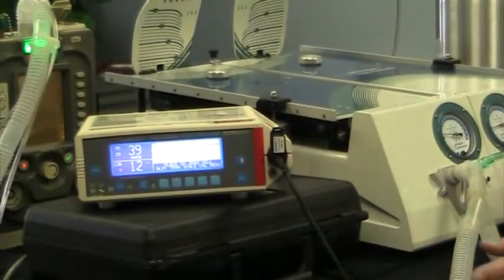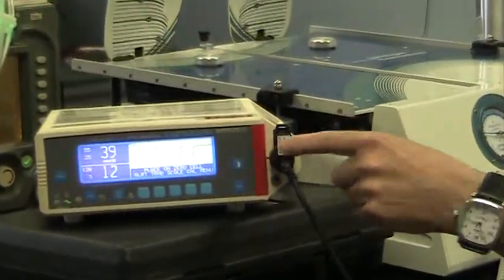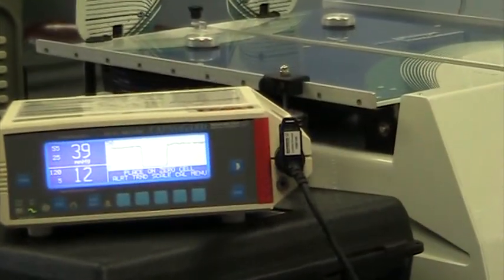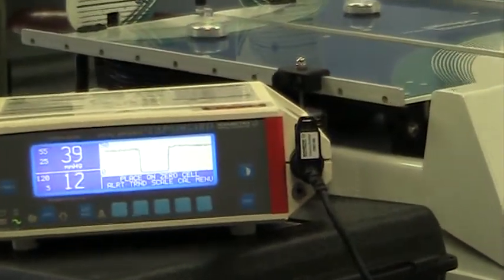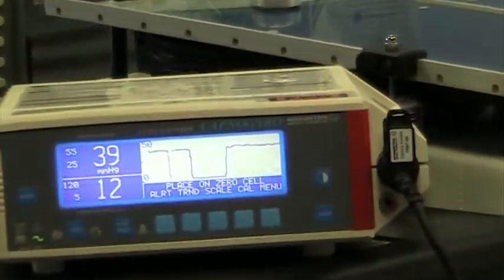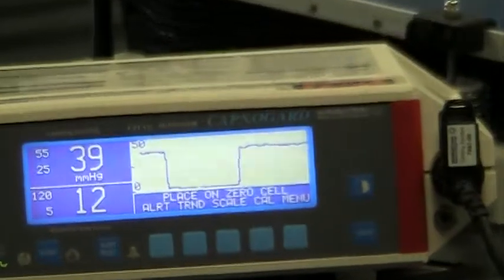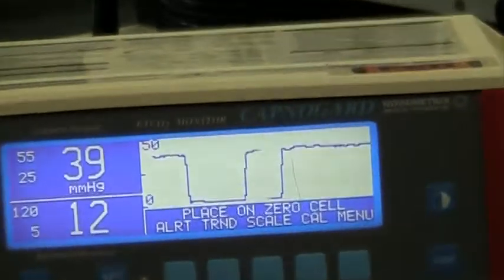If you zoom in here, you can see that we get a very regular waveform and a regular return of carbon dioxide.